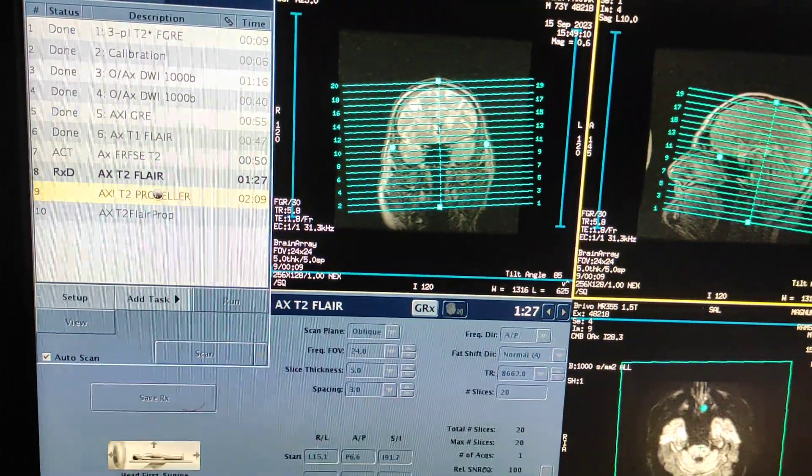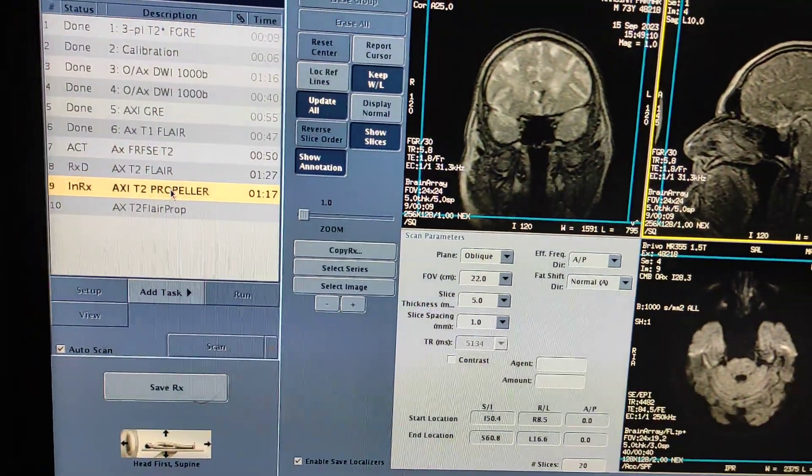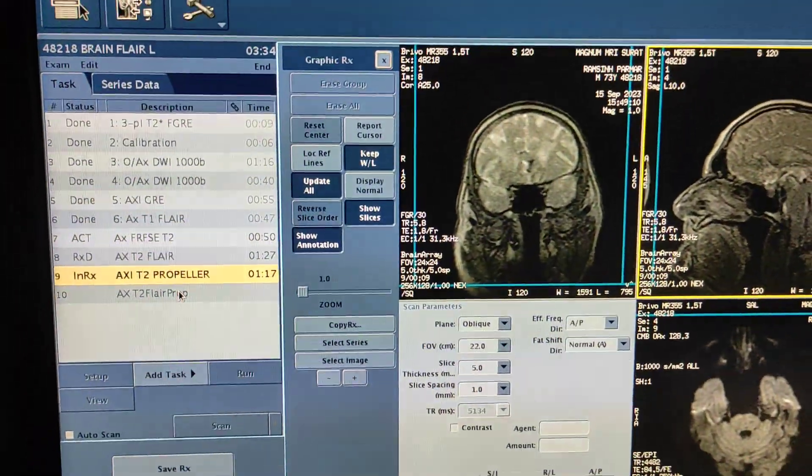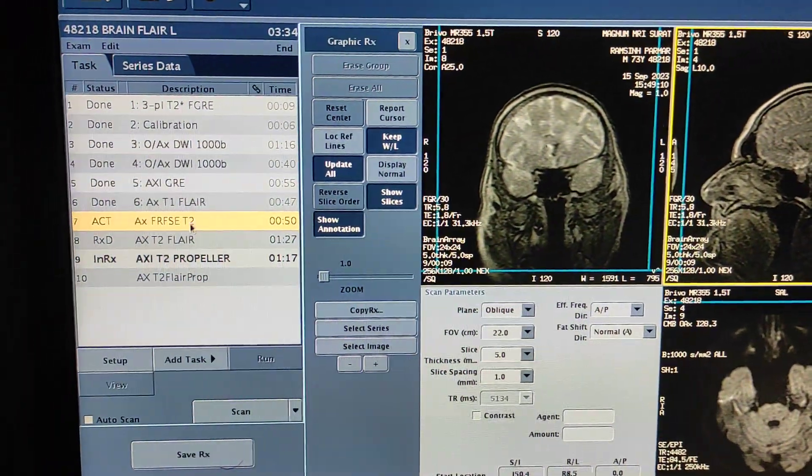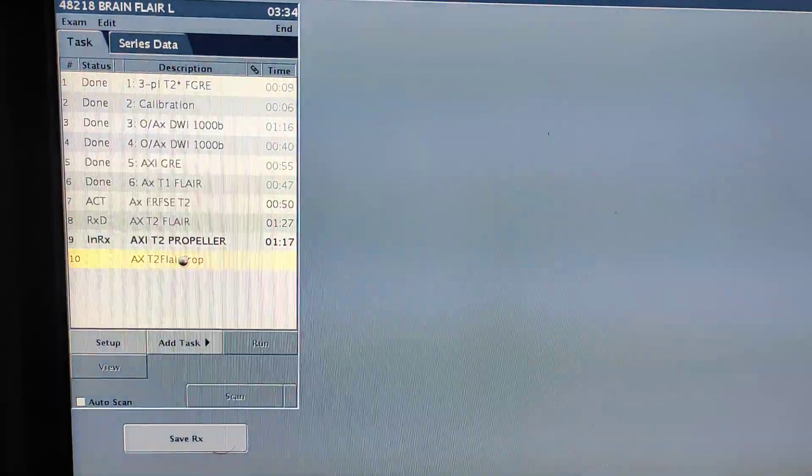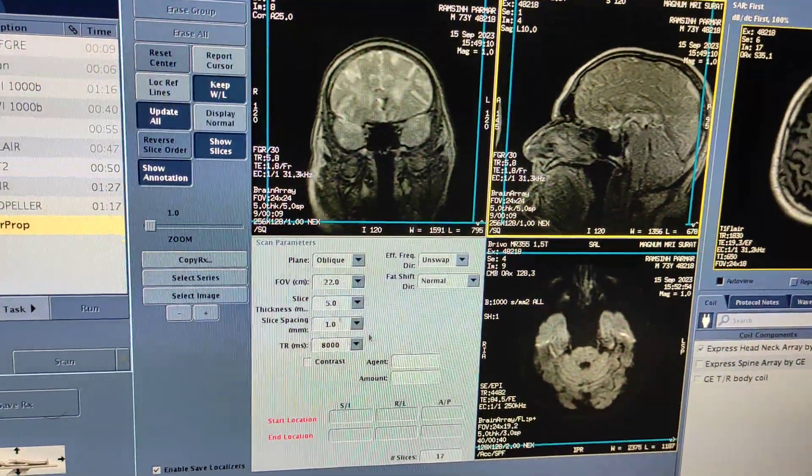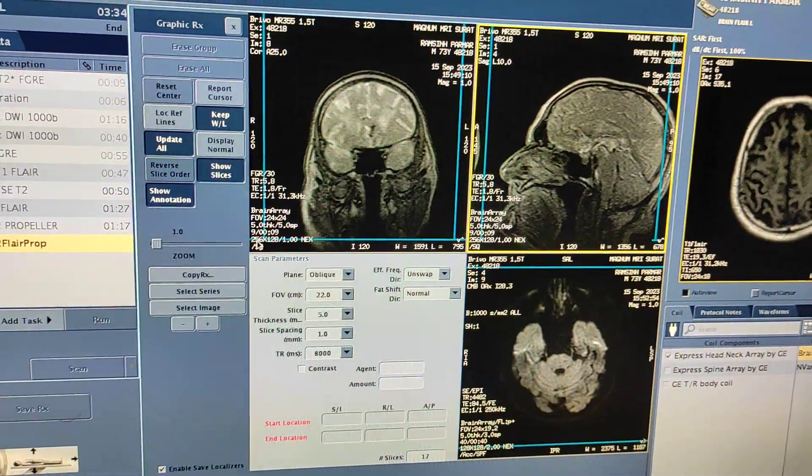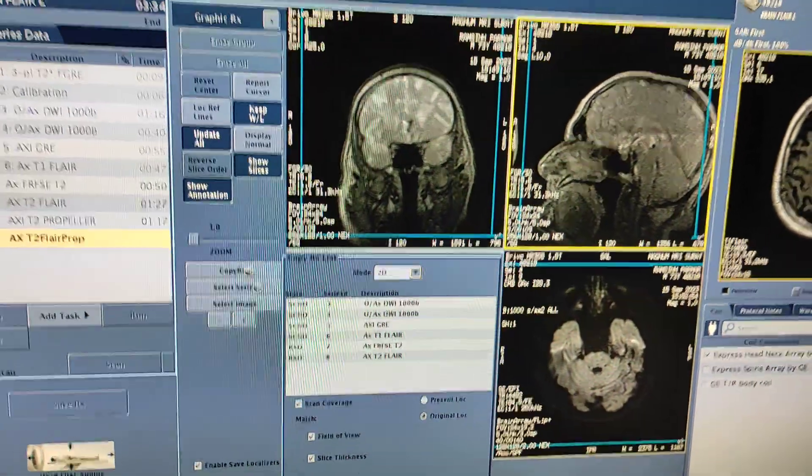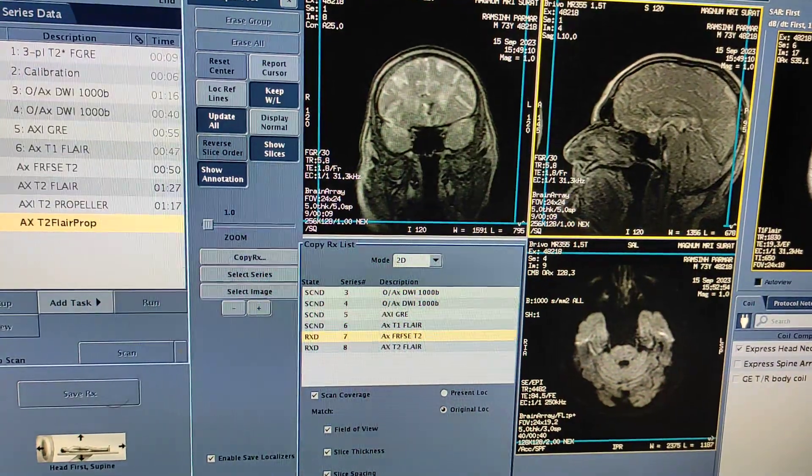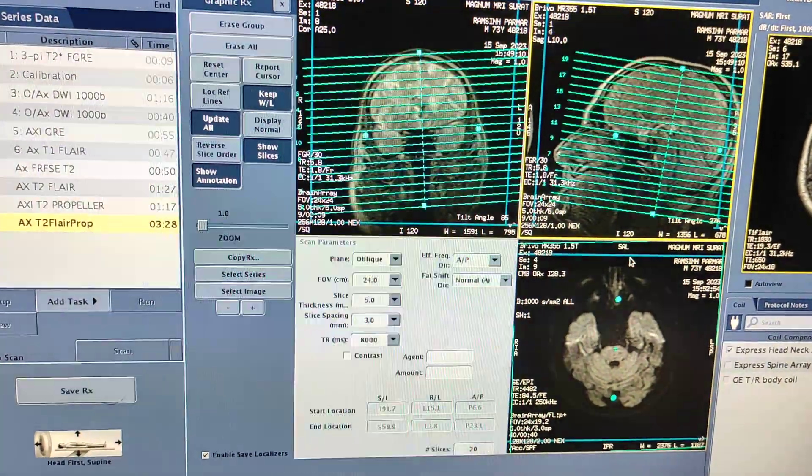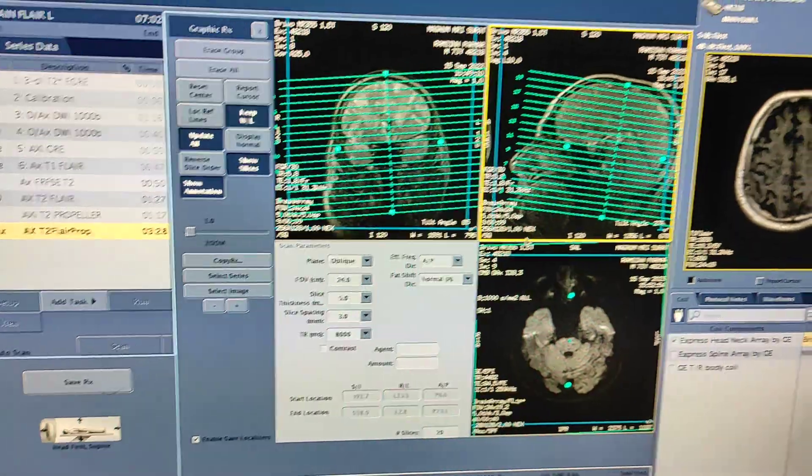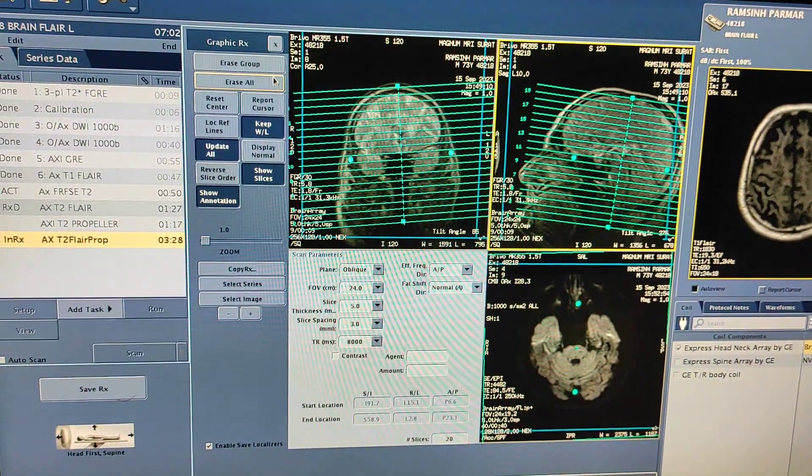I'm taking propeller scan for T2 as well as FLAIR. I have already planned the routine sequence. I will open the propeller sequence, double click to open. This interface will open. Now you simply click on copy to copy with the previous same sequence, so the same plan will be ready.